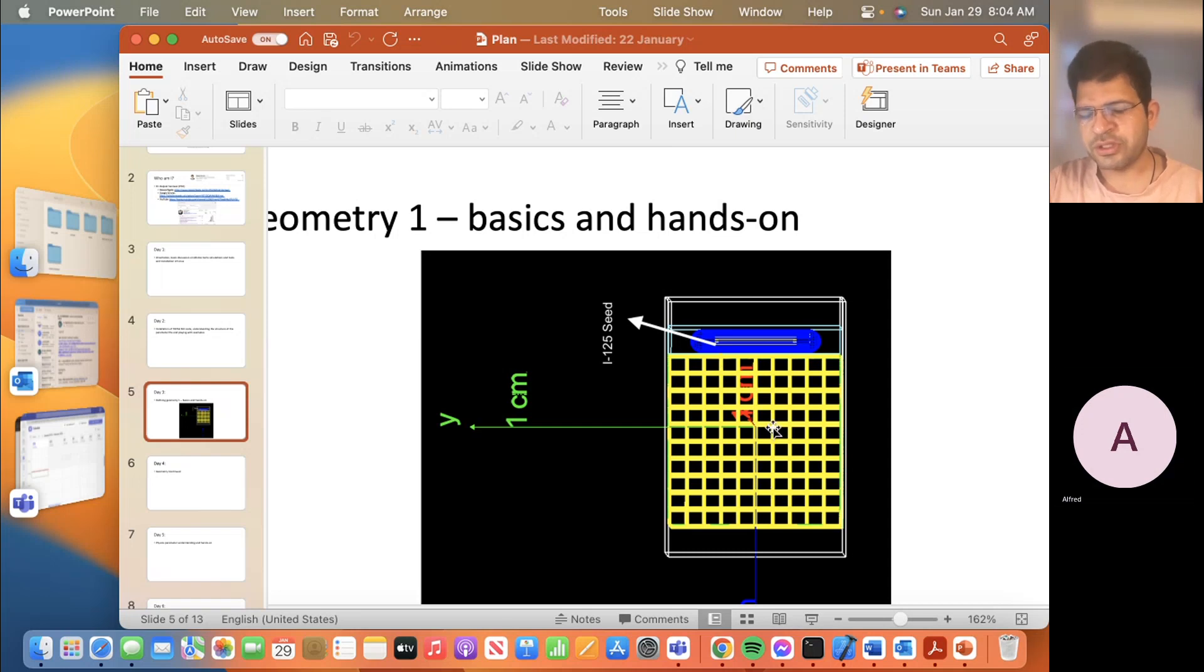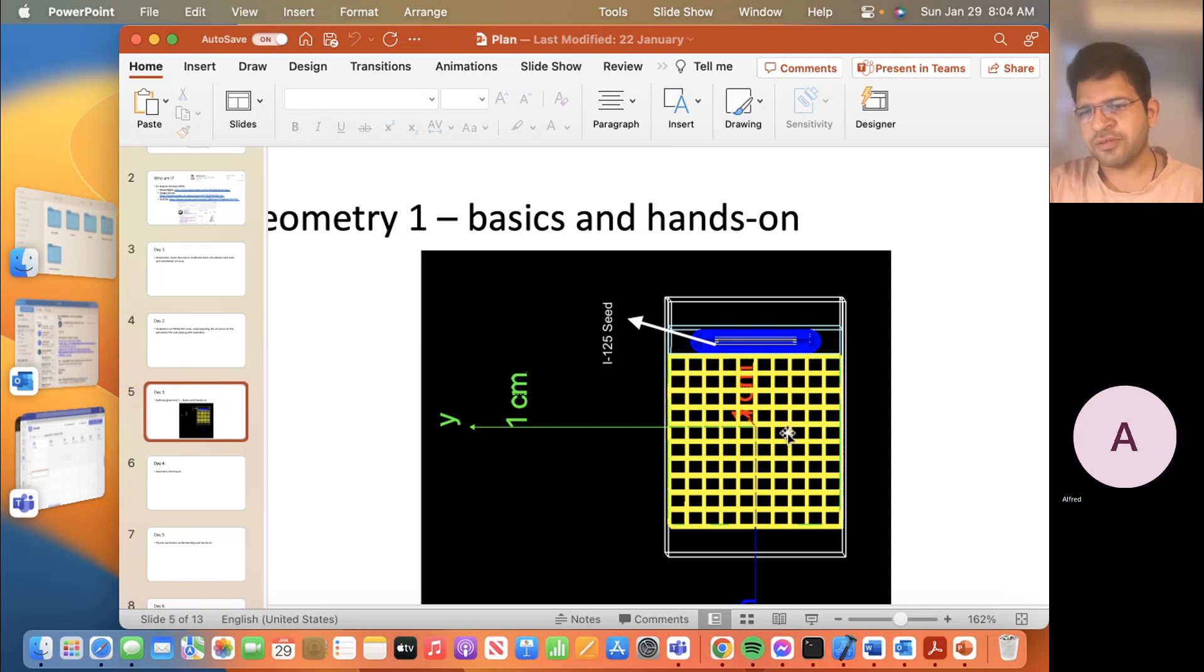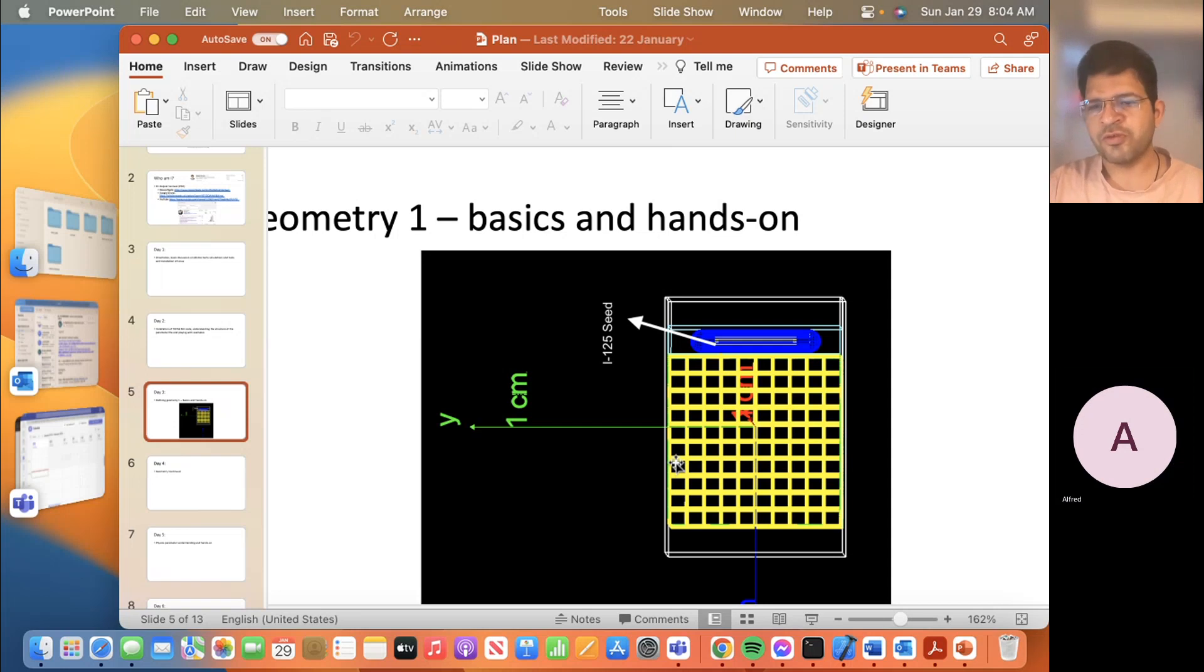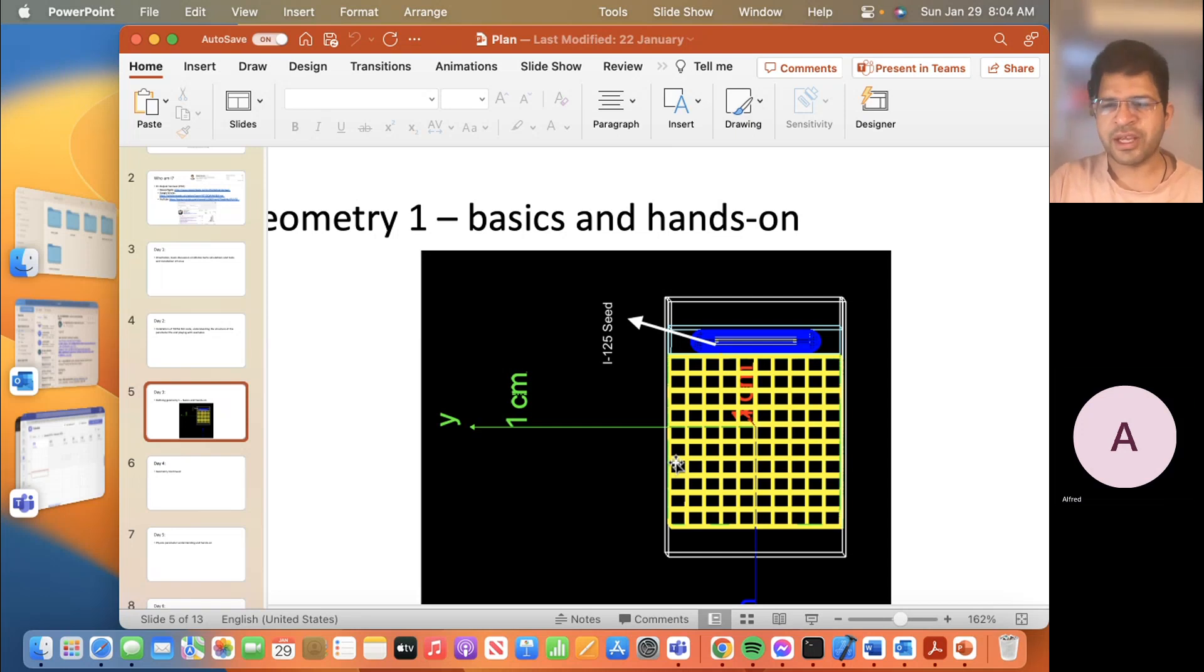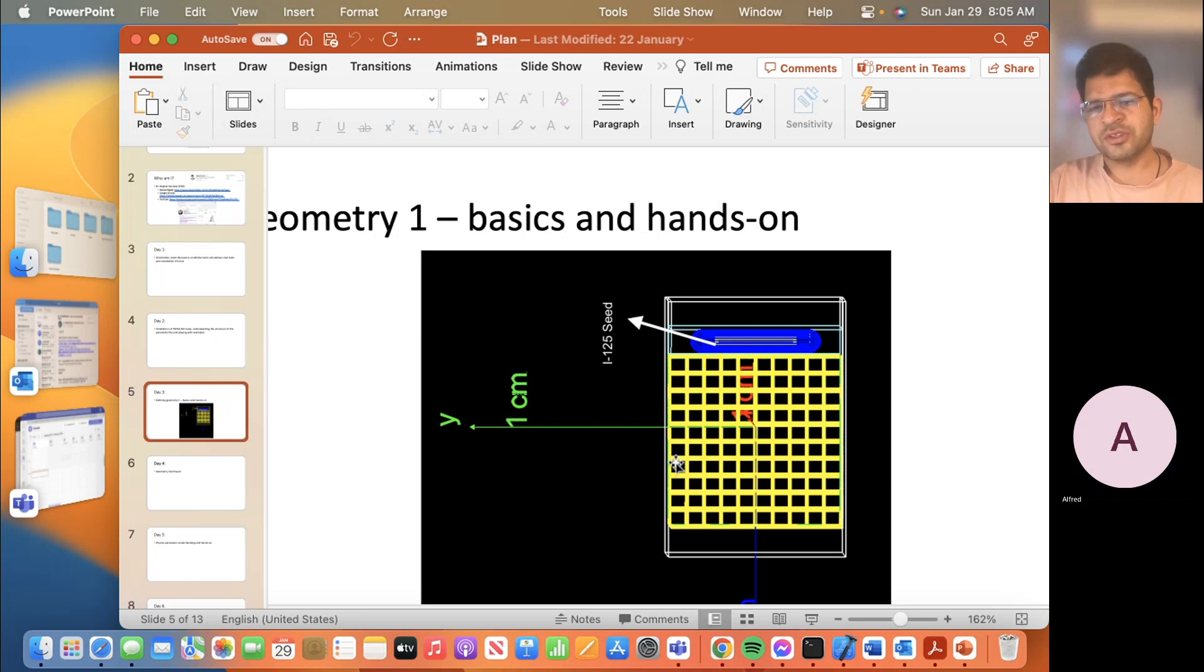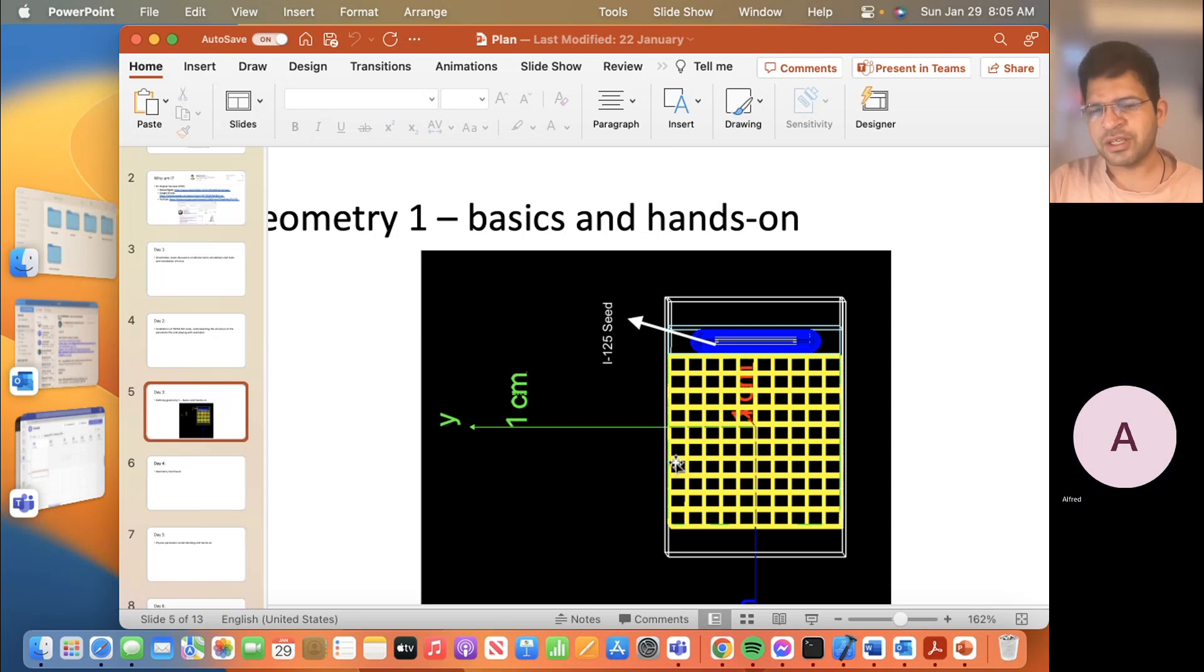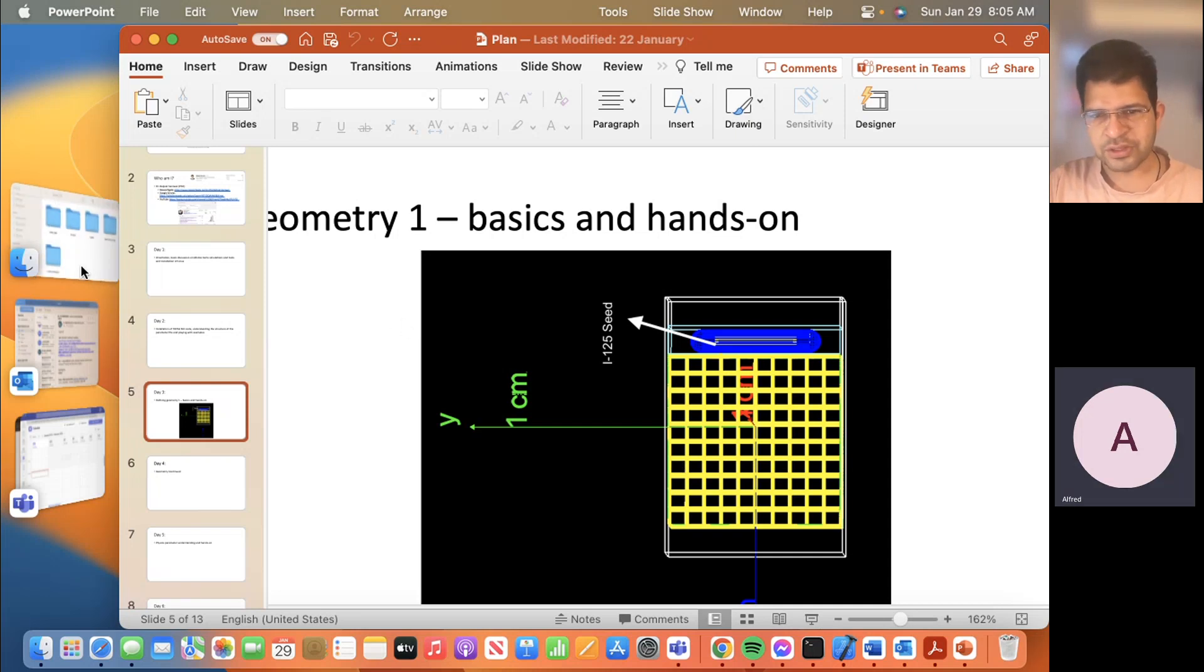Then this yellow mesh is actually a water phantom which I have divided into voxels of 0.3 mm side. We will be looking at what are the components and how you set them in TOPAS. Then we will move to the TOPAS website because I didn't want to prepare presentations since sometimes they make changes in the code. It is always best to go to their website and check for the details if you are confused about anything.